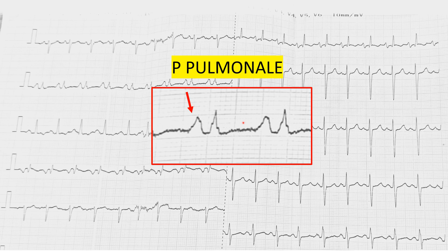This is a very important finding — P pulmonale. In the zoomed-in view of the long lead, we can clearly see that the P wave is very large compared to the QRS complex. By definition, P pulmonale must be 2.5 millimeters, and this is clearly much more than that. This finding signifies that something is involving the right side of the heart.